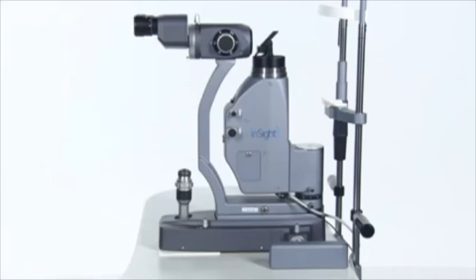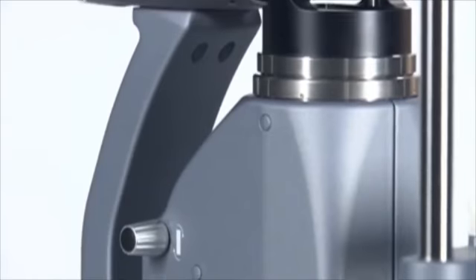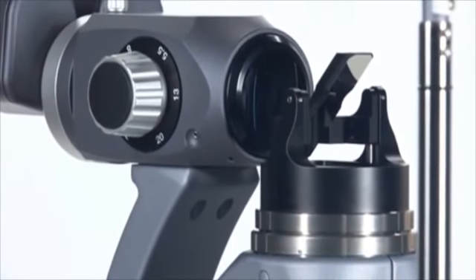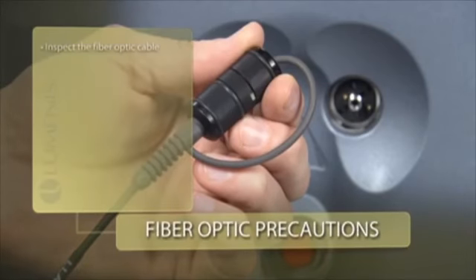In order to avoid possible damage to the laser, use only qualified Lumenis delivery devices. Using other than Lumenis delivery devices may jeopardize safe operation or damage the laser. When using a fiber optic delivery device, always inspect the fiber optic cable to ensure that it has not been kinked, punctured, or fractured, or otherwise damaged.